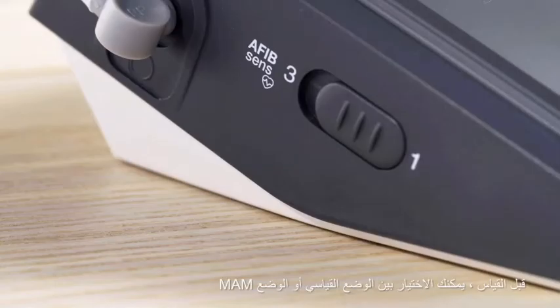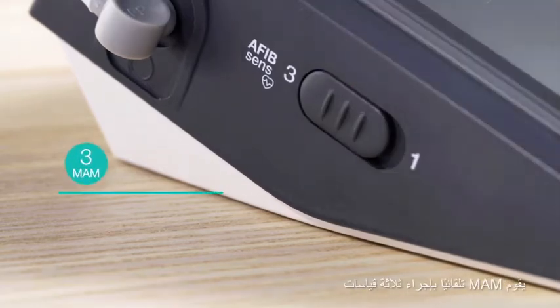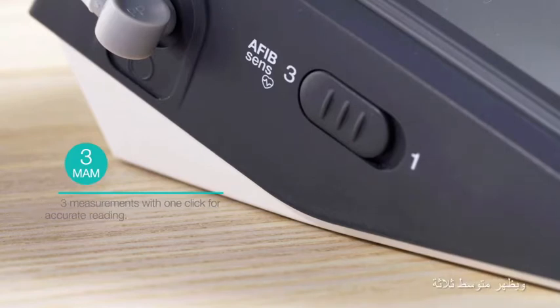Before the measurement, you can choose between Standard or MAM mode. MAM automatically performs three measurements with only one press of the button and shows the average of three.